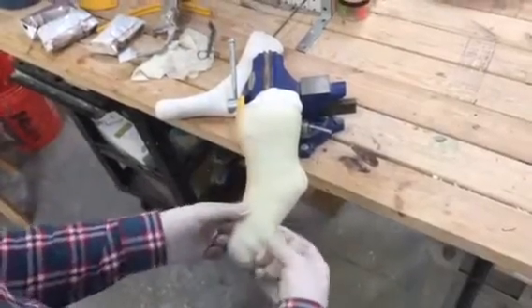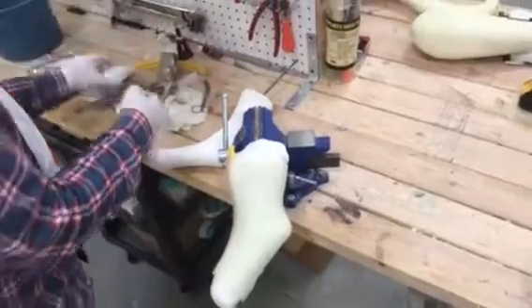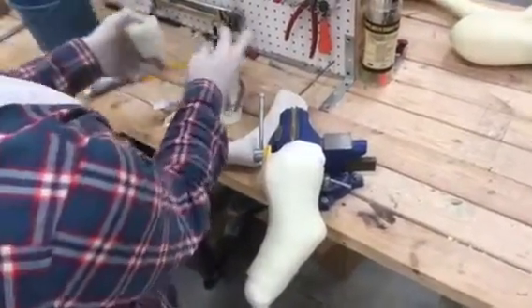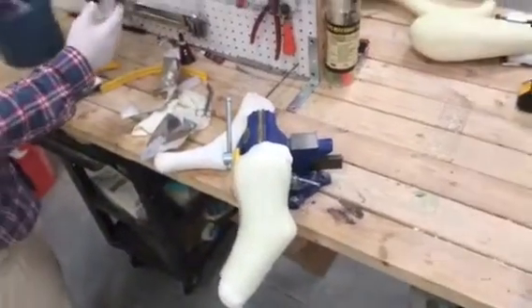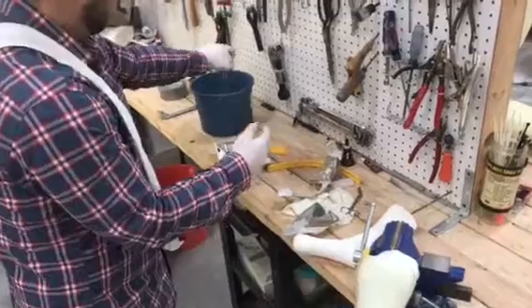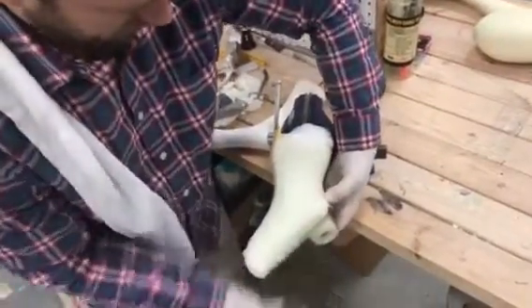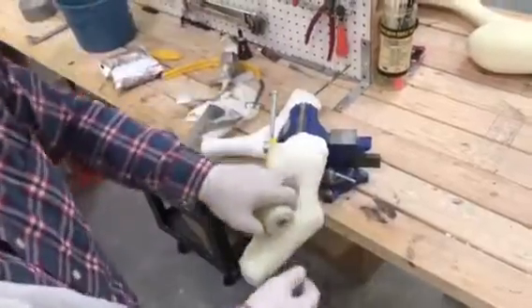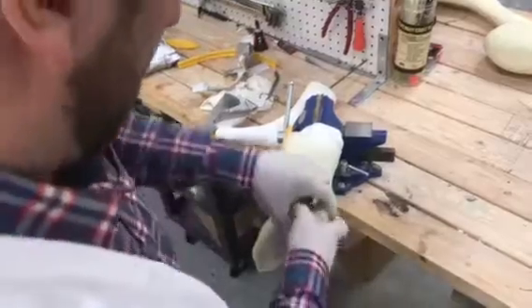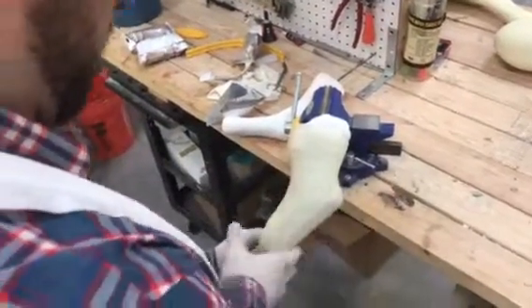I am running out of tape so I'm going to use two rolls. Two rolls is the normal amount of tape used for a medium to large sized dog that has an amputation like this. Again I'm going to do that longitudinal wrap and then come around and really encompass the bottom part of the stump. That just gives a much better mold.